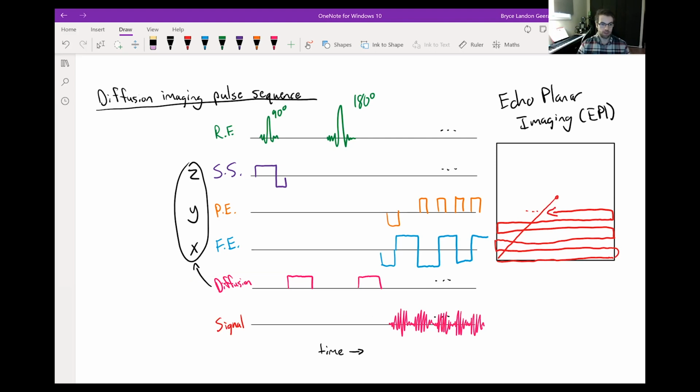So if, for example, we wanted to acquire or probe diffusion in the Z direction from bottom to top of the body, these diffusion weighted gradients, let's see if I can just move them, would just be up here, right? They would actually just be gradients that are applied along the Z-axis. Also, this is a good reminder that I have not drawn our second slice selection gradient, which definitely exists, I promise, just to balance our 180-degree pulse as well.